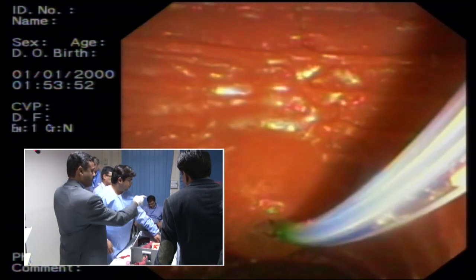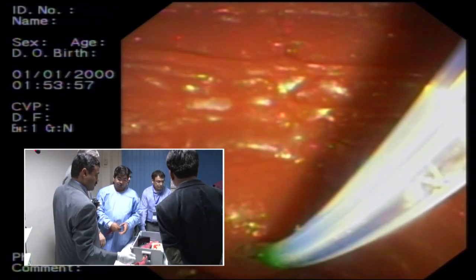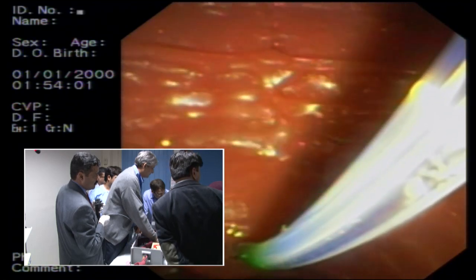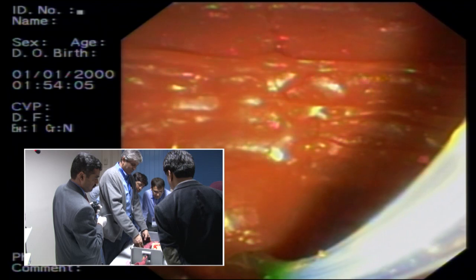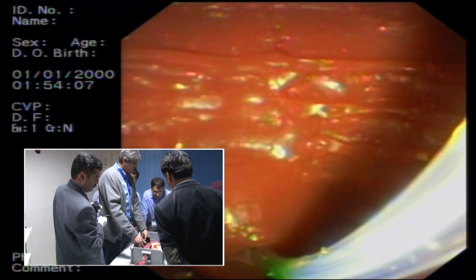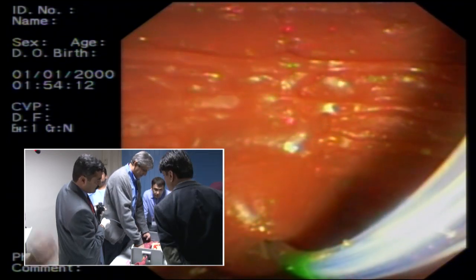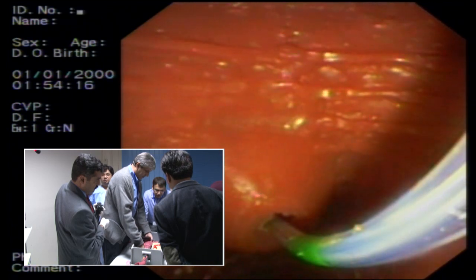राइट सर. हाँ शायद पोजीशन थोड़ी सी बेहतर कर दो. ये बहुत है. Actually the balloon is stomach is not completely balloon. Take your air out. But stomach is एक आखिरी रहेगा. बस ये काफी है.